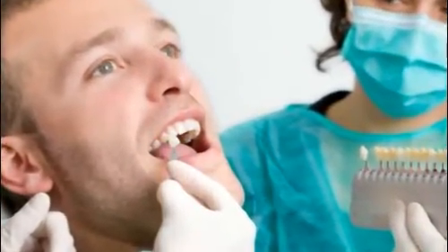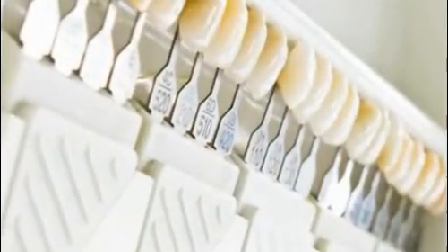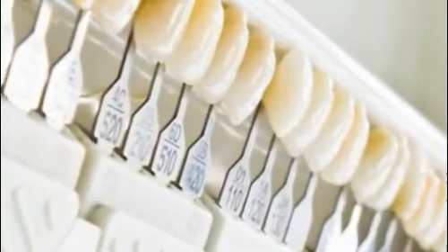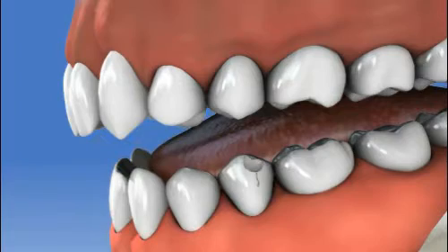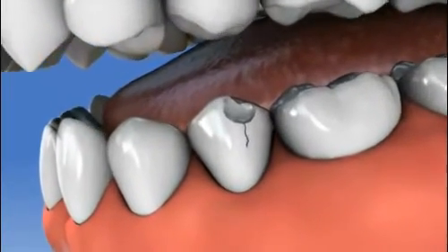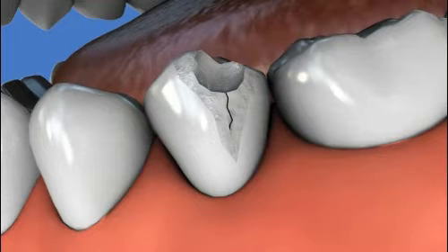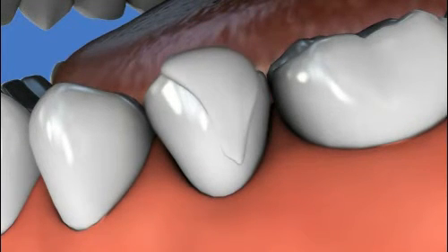Dental bonding usually requires little or no advanced preparation. First, your dentist will use a shade guide to find the color of the composite material that best matches your natural teeth. Next, the dentist will rough up the surface of your tooth and a conditioning material will be applied to help the bonding resin adhere better to your tooth. The dentist will then take the perfectly color-matched clay-like resin, apply it to the tooth, and mold and shape it as desired.